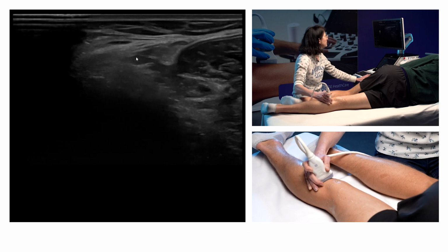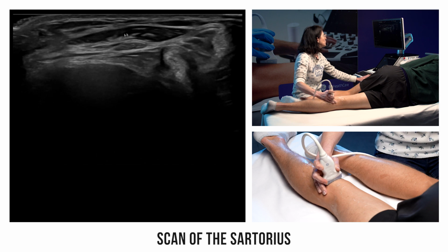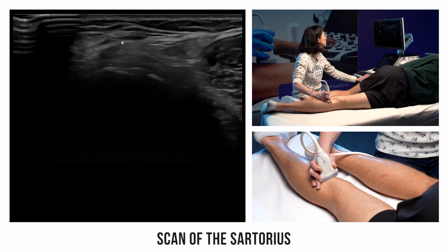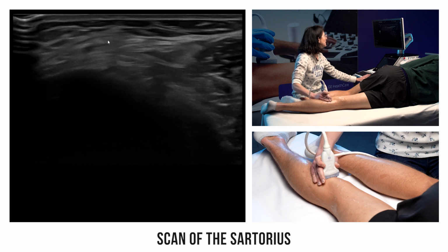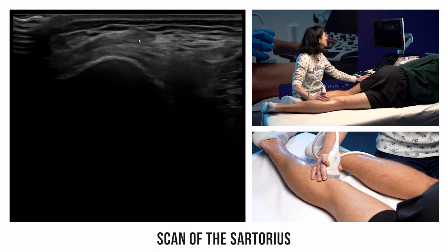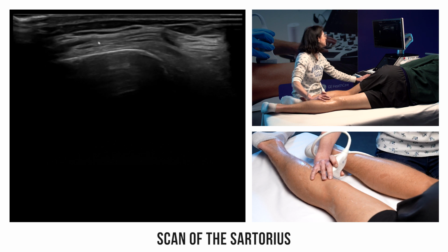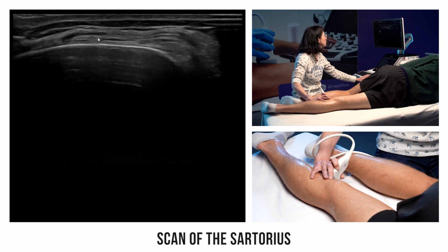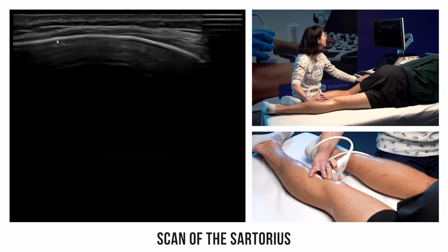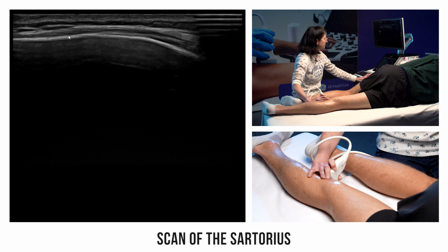The last one is the sartorius. Here, a muscle that goes relatively low, which wraps around the medial collateral ligament, and the tendon fibers here, we go down, and the fibers, which are relatively thick in principle, and here again will orient themselves towards the front. You should see the position of my probe practically in the same axis, but here the end of the tendon is seen in its long axis, we could say.